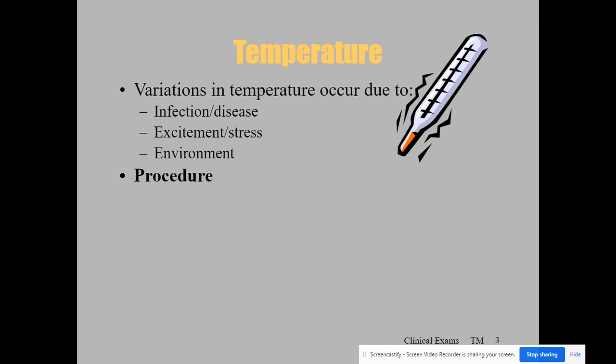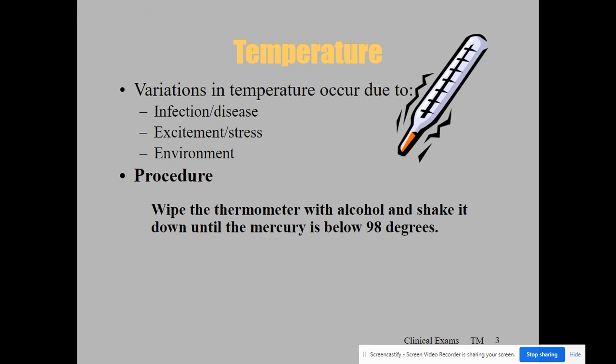So, procedure. The first thing we want to do is make sure that the thermometer is clean. I think in this day and age, the importance of making sure everything is clean and washed is probably something we're all sick of hearing about, but it's very much true. We want to make sure that the thermometer, that tool, is clean because we're putting it into an animal, and we don't want to take anything from the outside and stick it into the insides of our animal with bacteria or something on it.